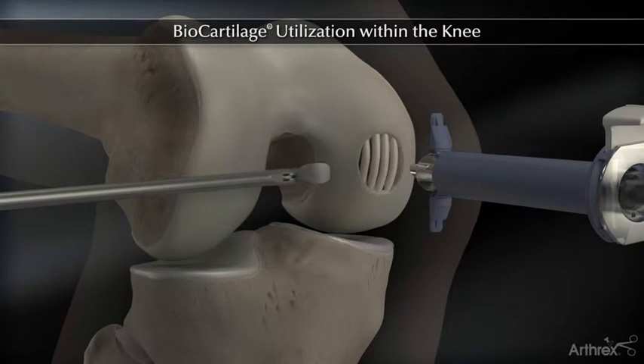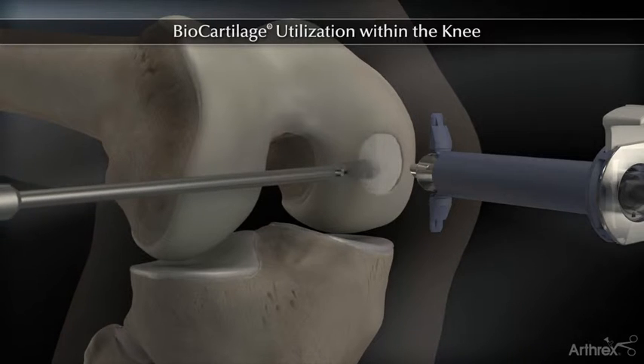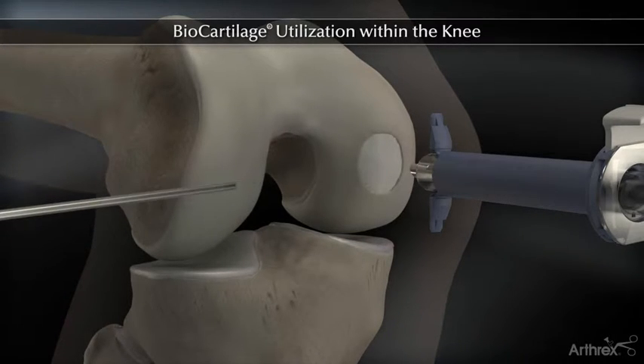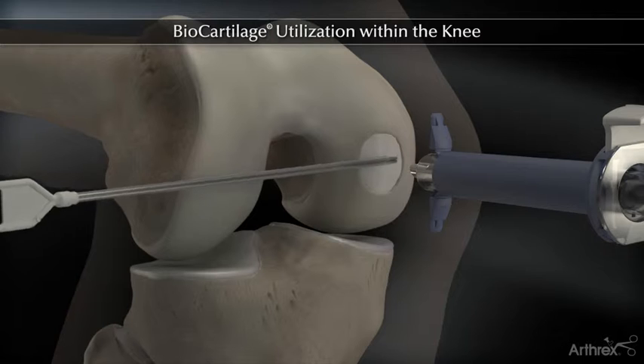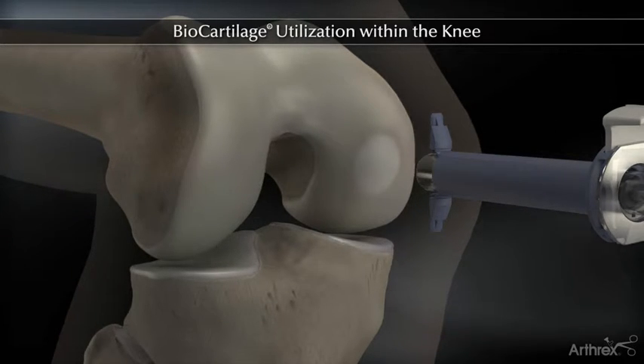The articulating paddle elevator can be used to smooth out the biocartilage, leaving it slightly recessed to the surrounding cartilage. Apply a light layer of fibrin over the construct and allow it to sit for 5 minutes before manipulating the joint.